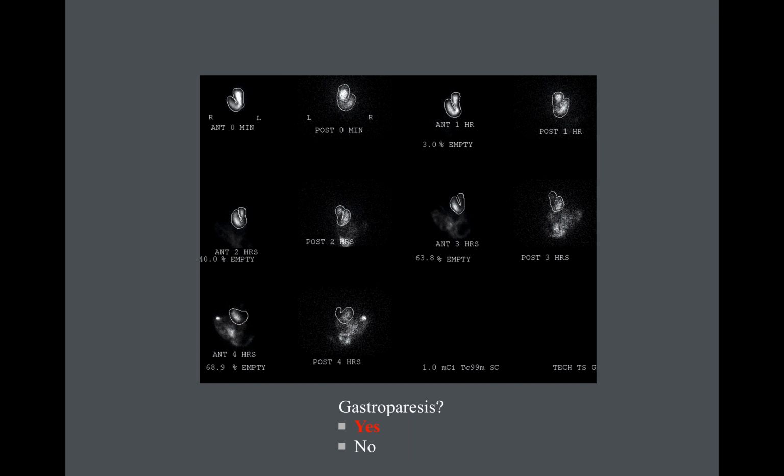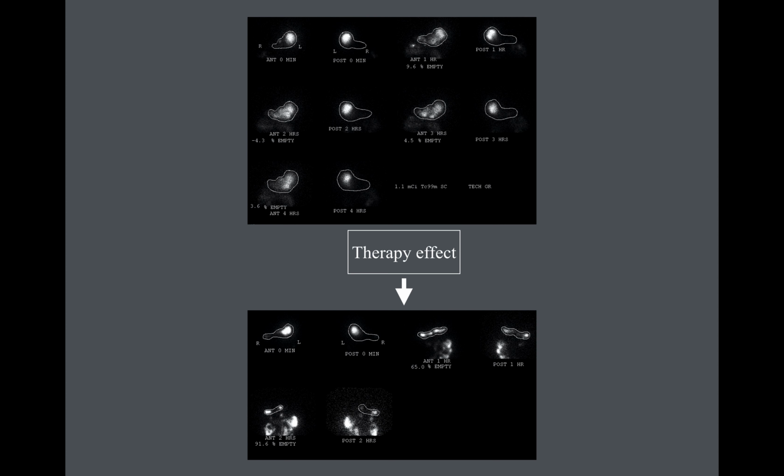The scan above is pre-therapy, and we see 4% emptying at 4 hours. And after therapy with medications, we see by 2 hours the patient is emptying at 92%. So again, this is why we image at hourly intervals, because we can frequently terminate the scan quicker.